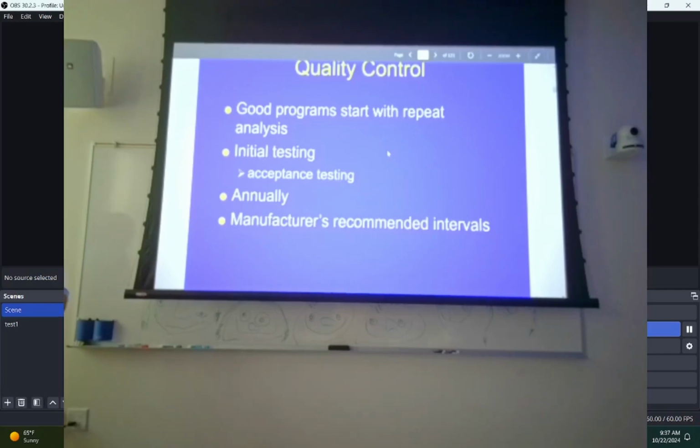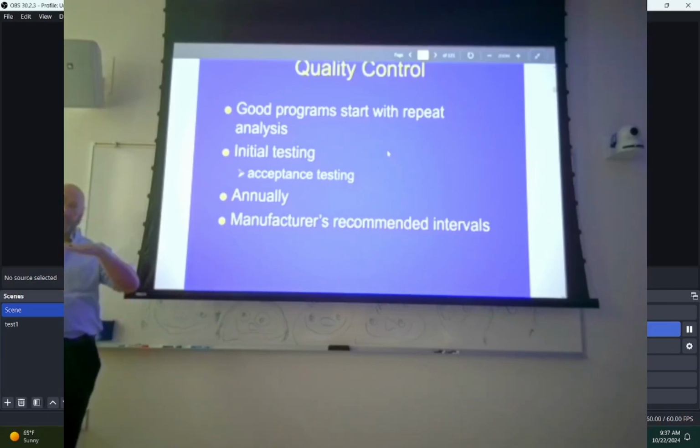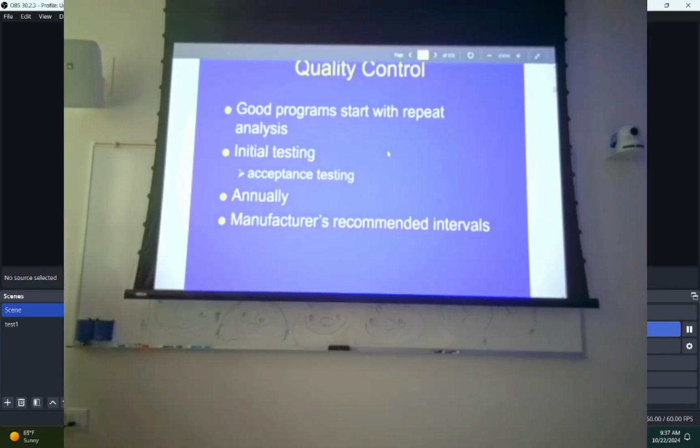Well, it could be that our phototimers, our radiation cells are inaccurate, not receiving the right amount of radiation before terminating the exposure. Are we setting techniques, in which case we need some education on proper techniques? So, what's going on with it? Are we clipping anatomy? Is the anatomy that we're clipping strictly on one side of the patient, indicating the mirror might have fallen off? So we got to have some sort of analysis.